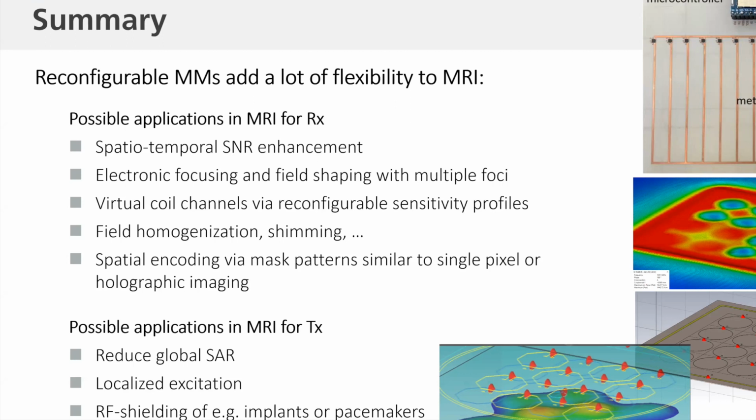And the interesting part, that's something I'm glad that you're touching, because right now we are only modulating by amplitude. In principle, you can also modulate by phase. So you can also get phase patterns, and then you wouldn't be losing the signal. Yeah. And then we are again at, I'm not even sure what the word for that is, phase encoding MRI. Do you have an opinion about this approach where they use RF phase imprinting instead of gradients?